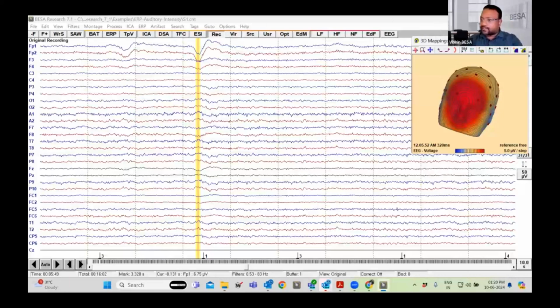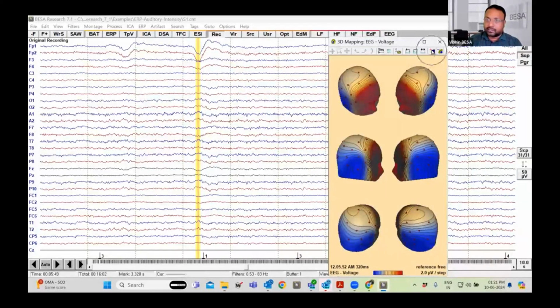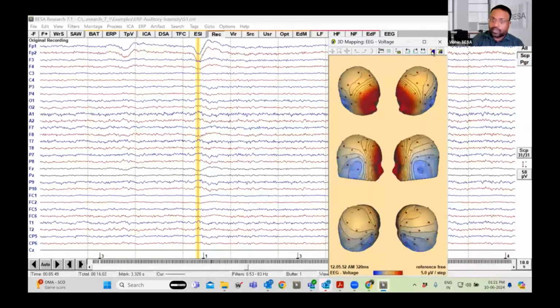Okay, next, what I wanted to show is this map, which you see here on the right side. When double clicked, it gives you the 6 different angles of viewing the same activity at the same time. There are multiple ways to see this. If you want to see an increased intensity version of this, you can just use this plus button on the right side, or you can also use the up arrow or down arrow on your keyboard, and you should be able to change and see it clearly.